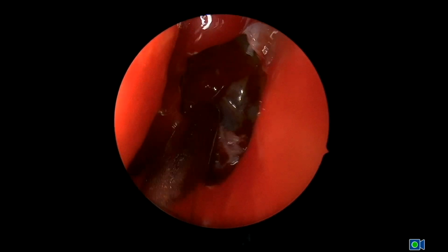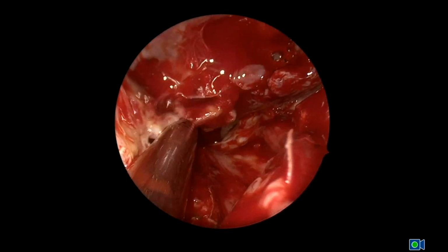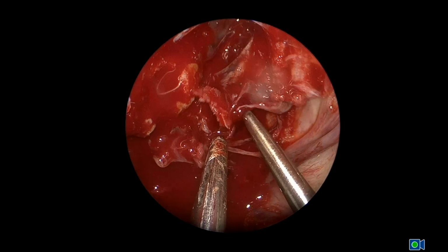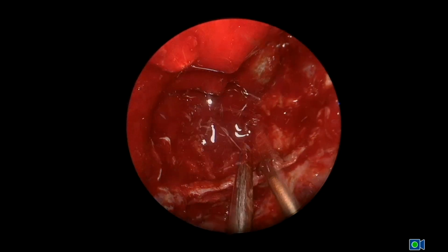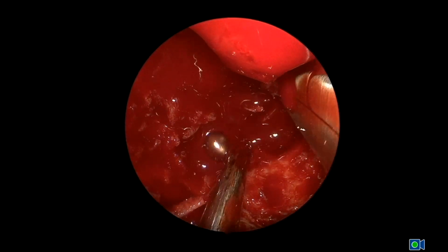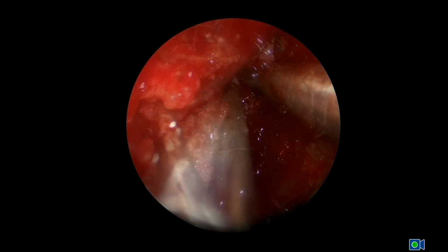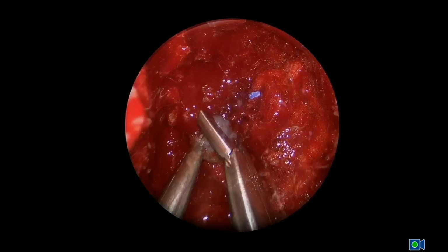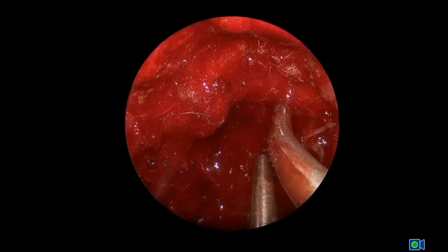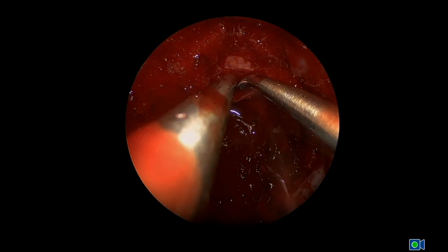First, our ENT group is performing the sinonasal stage of the operation, opening into the nasal cavity. We start removing some of the initial cysts, identifying the nasopharynx inferiorly, or the nasopharyngeal fascia, all the way down to the clival bone posteriorly. We see some of the involved bone that is being removed, some of the small cysts, using the Doppler ultrasound, trying to find the carotid artery.